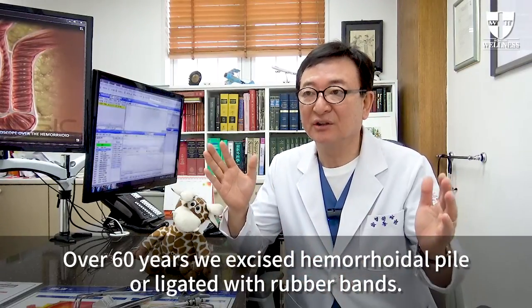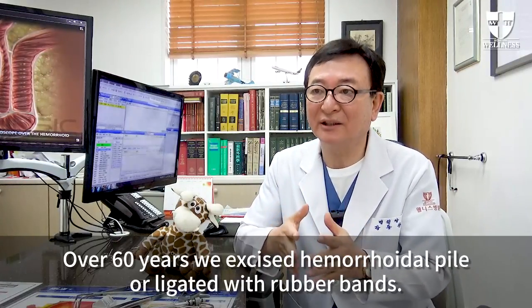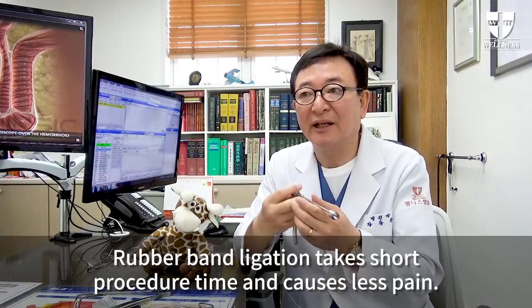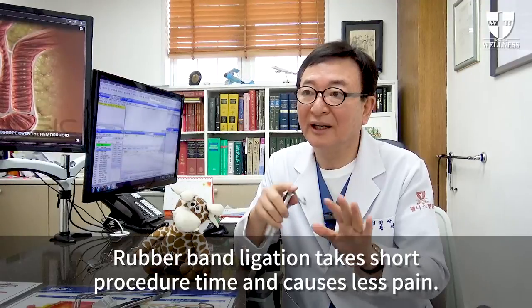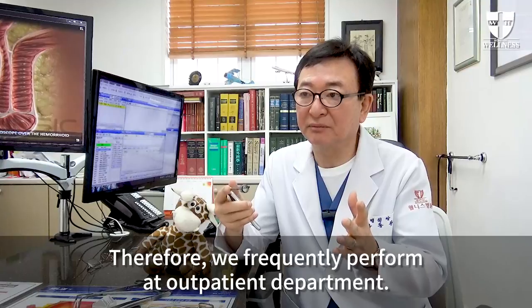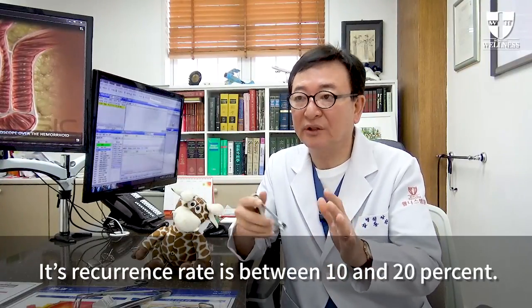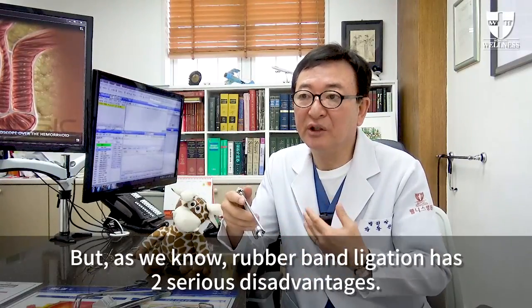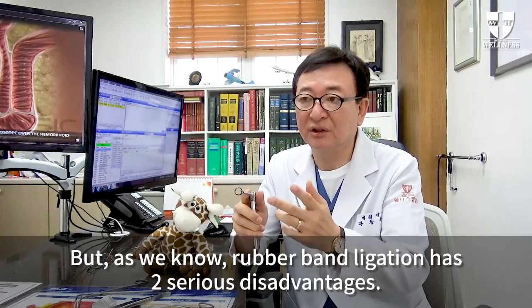Over 60 years, we excised hemorrhoidal pile or ligated with rubber bands. Rubber band ligation takes short procedure time and causes less pain. Therefore, we frequently perform it at our outpatient department. Its recurrence rate is between 10 and 20%. But as we know, rubber band ligation has two serious disadvantages.